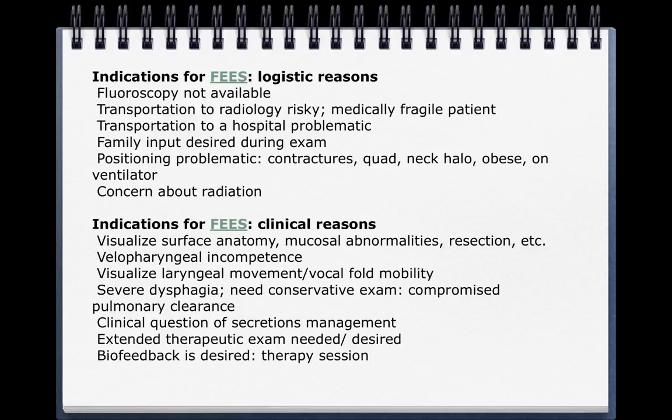Or you teach them they need to turn their head when they swallow, and you want to see if that maneuver, that exercise, can improve airway safety. If so, then it is a way for you to check. It's also a way for the patient to essentially get biofeedback about whether or not they're protecting the airway sufficiently, because they too can see the screen and figure out if that maneuver is helping protect the airway or not.